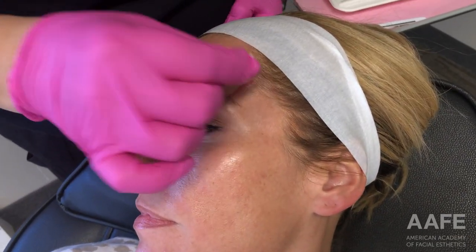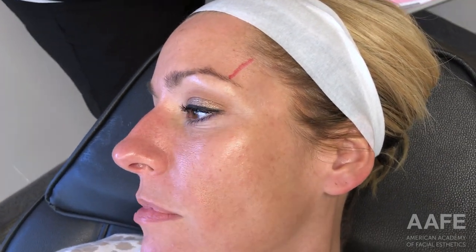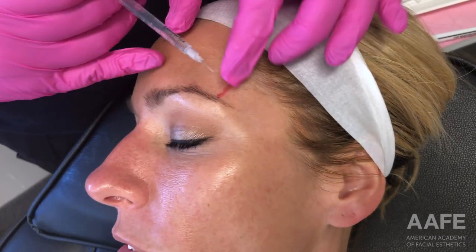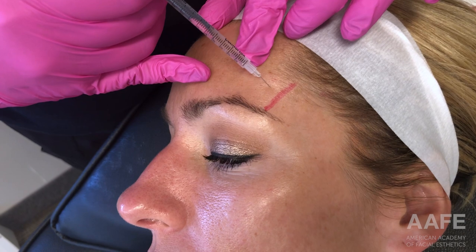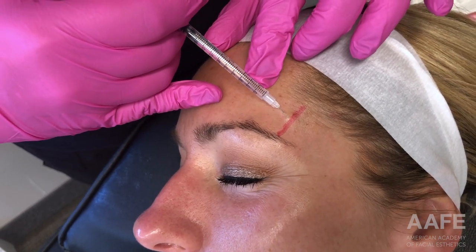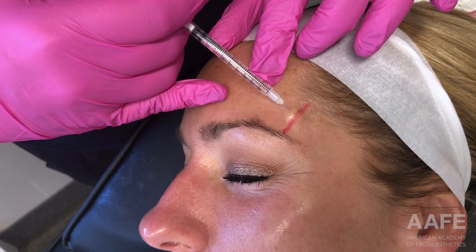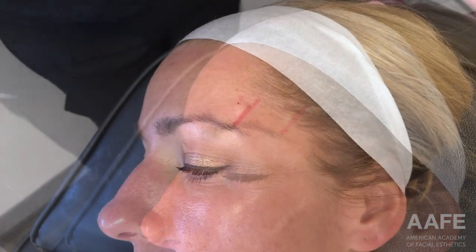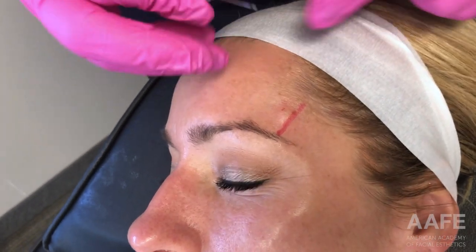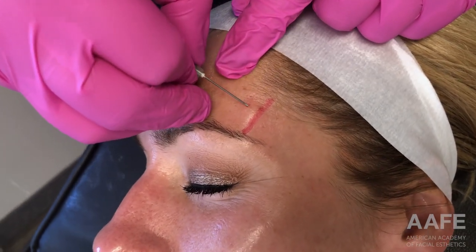We used Radiesse Plus in this particular treatment, so we used saline as the diluent because there is already lidocaine in the Radiesse Plus. I used 1.5 cc's of bacteriostatic saline to 1.5 cc's of Radiesse. As you saw in the beginning of the video, I was blending the saline with the Radiesse very well so that we have a nice, smooth blended product.